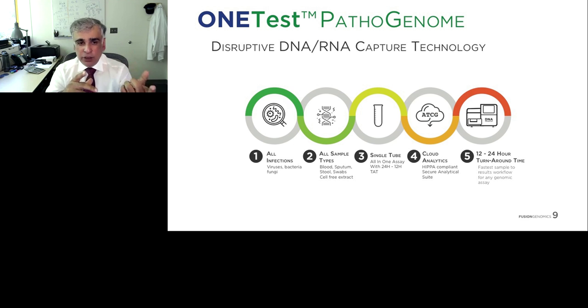It's a single tube assay, which means that you add your sample, I need to correct that, you add your nucleic acid. So whatever biological sample you have, you will then isolate your DNA or RNA, depending upon what you're interrogating, or both, and then you would add it into the tube. And once your target is enriched, it's put onto the sequencer, and then all the data goes to a cloud where it is analyzed, and you are provided with a report.